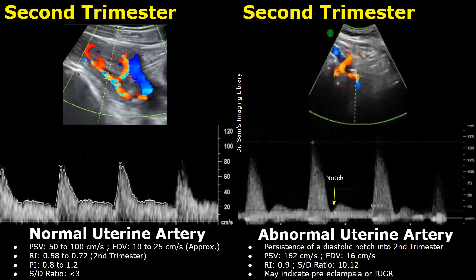This is another example of an abnormal uterine artery spectral Doppler during the second trimester. We find the early diastolic notch here. The resistive index is increased, and the SD ratio is 10.12, which is very high. So this is abnormal. These types of abnormal values may indicate preeclampsia or intrauterine growth restriction.